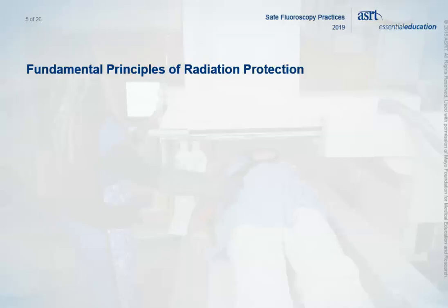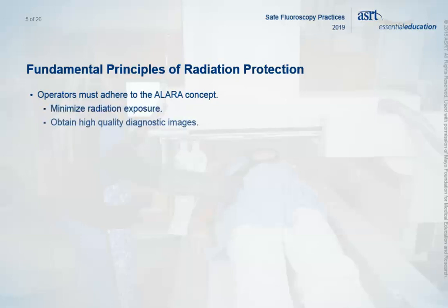Fluoroscopic examinations can potentially deliver a considerable radiation dose to the patient. Operators of fluoroscopy equipment must have a complete understanding of all parameters affecting patient dose and adhere to principles of the as low as reasonably achievable, or ALARA concept. The goal of this concept is to minimize radiation exposure while obtaining the best quality diagnostic image possible.